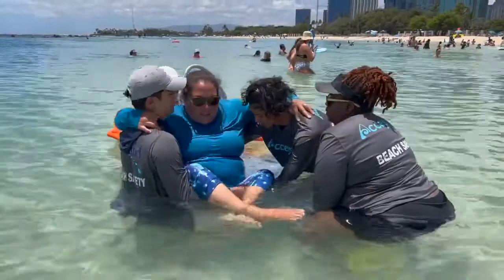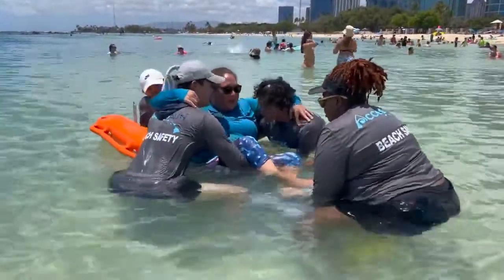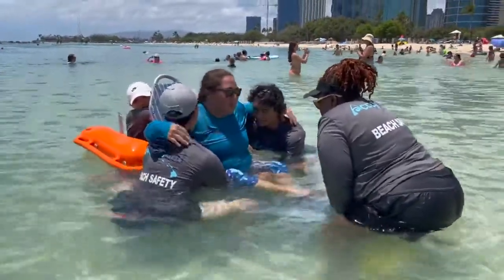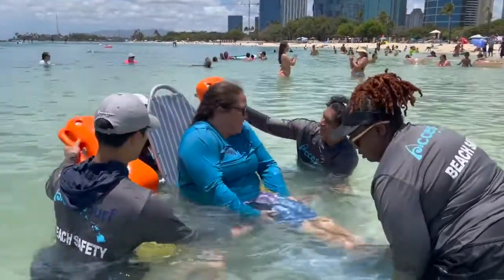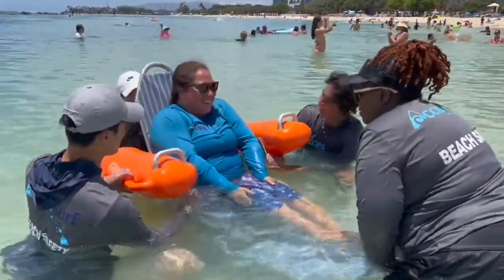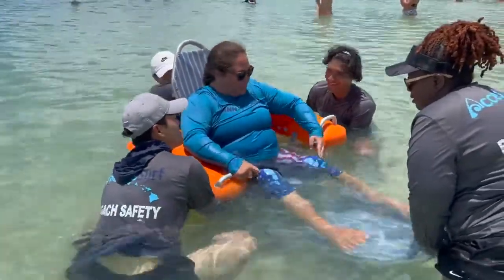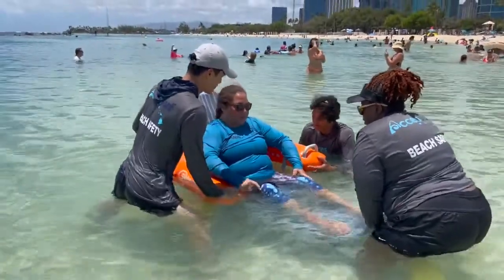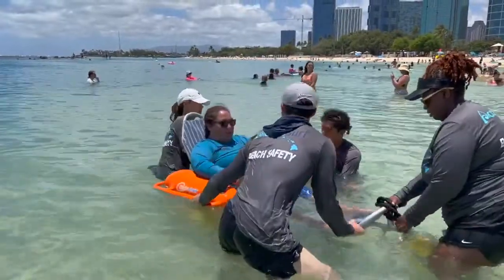The same procedures should be done when the participant is being transferred from the water into the Mobi-chair. Volunteers should remove the armrest if needed, sink the chair, and assist the participant as needed. Once the participant is in the seat, the armrest should be resecured and volunteers should release the chair from the sunken position slowly and with control. Then the team can start to move the chair out of the water.